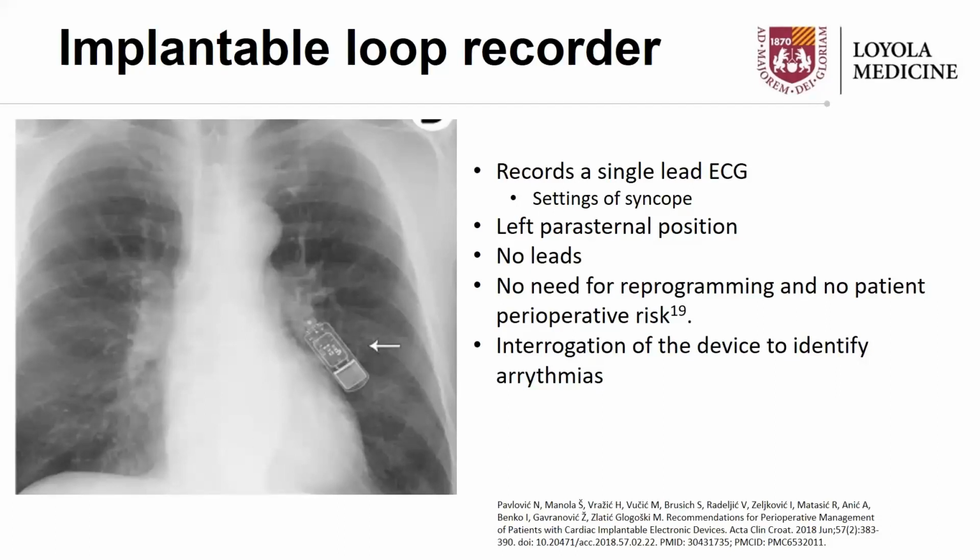So it's good to know that. And as far as MRI safety, the shell is made of titanium and the inside contains ferromagnetic components. So the device is safe to use in MRI, but the patient should be consulted that a pulling sensation may be perceived, which I thought was interesting. And just requires some patient education. And lastly, you should talk to your patients about letting their cardiologist know at their next follow-up appointment that they had recent surgery, because perceived arrhythmias detected on the device could in fact be interference from electrocautery during the procedure.